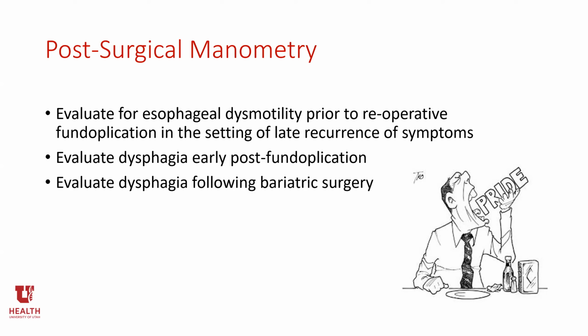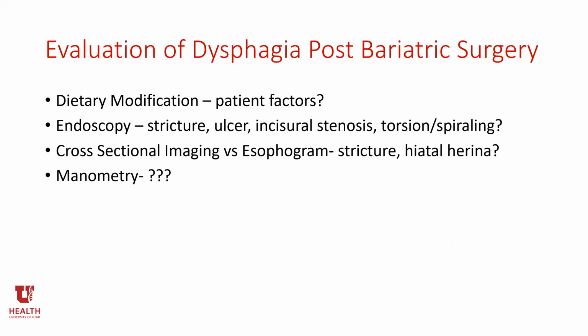Sometimes manometry can be very useful in these patients. Occasionally, it can also be useful in dysphagia following bariatric surgery, and I've been asked to speak about these three instances today.